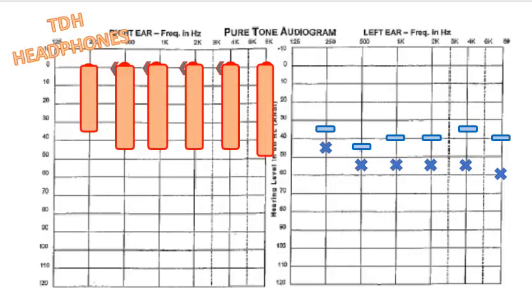So let's add some narrowband noise masking to the right ear and retest the left. And after masking the right ear, we see that the left ear thresholds did not change. They were accurate all along, but we have to be 100% sure before calling them a threshold. They were not acceptable without the masking, because it was possible that the right ear could have been hearing them.